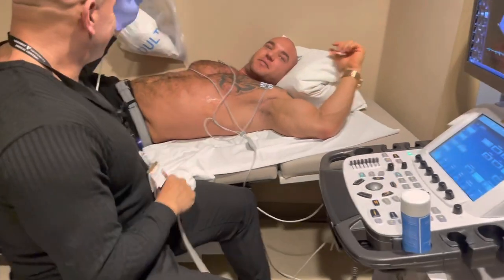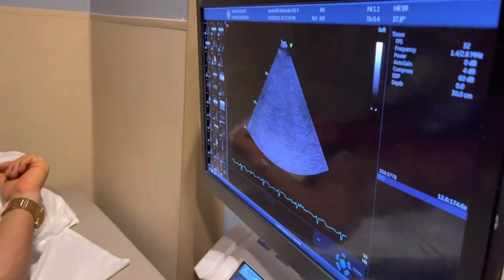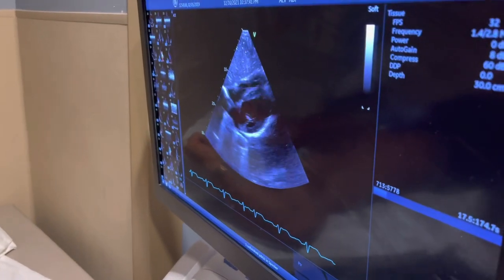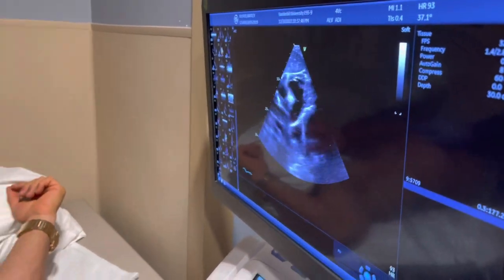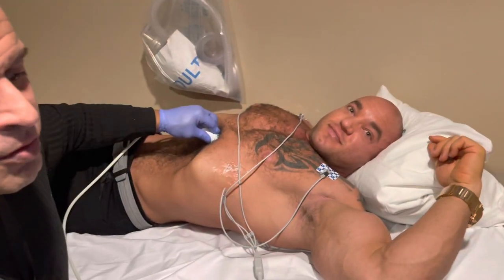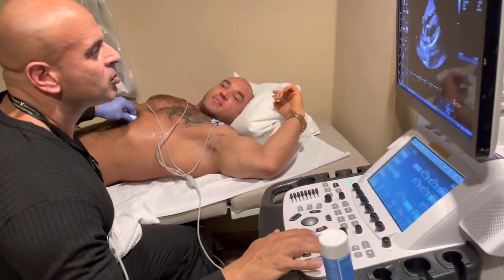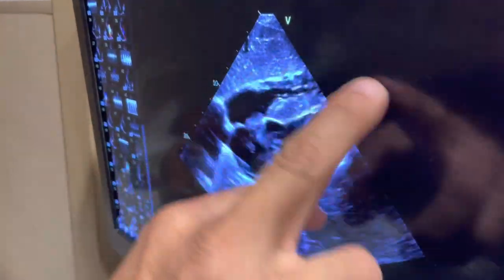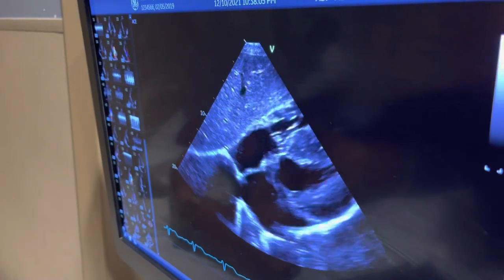So I'm going to look at your heart from down here now. The reason we look at it from here is we want to make sure there's no fluid around the heart. Perfect. We're looking at his heart from the bottom, angling up. We don't see any fluid around it. If there was, we would see a dark space right around it.